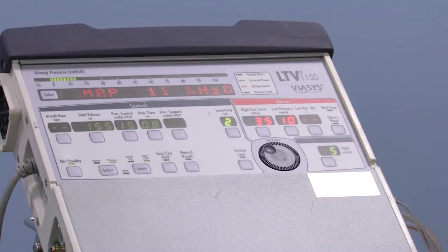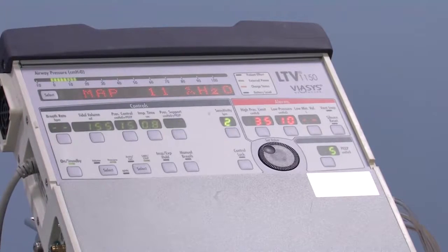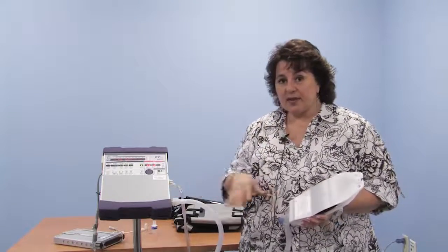I should mention that the LTV ventilator can also be used non-invasively. So we could use pressure support or BiPAP with a mask on the LTV. That may be done with your child as well. They could use a nose mask or a full face mask. Some practitioners are now using cannulas to ventilate, to do CPAP at least with this ventilator. So a trach isn't always the only route of administering ventilation to your child.